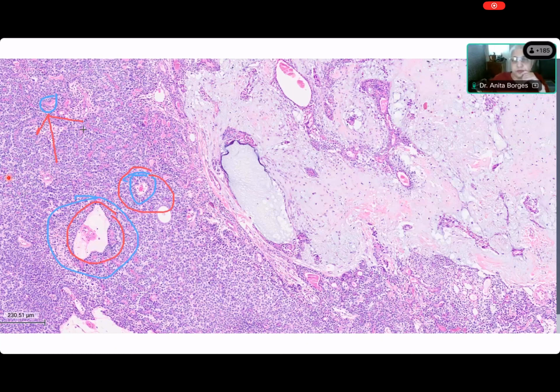Tell me the difference now. The space lined in red is a stromal space because there are vessels inside. Excellent. Yes, it's a stromal space. It looks as if it's a space, but there are vessels, and there is probably edema or something else filling this space. And these other spaces happen to be luminal spaces. So we've got two kinds of spaces over here, and this is important.